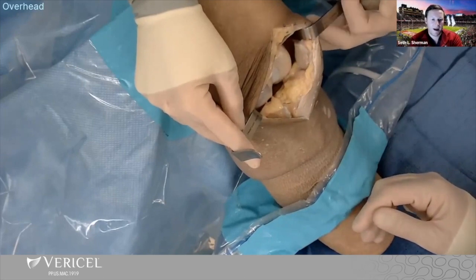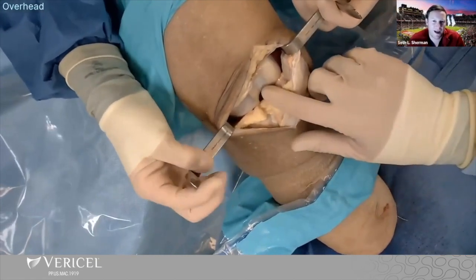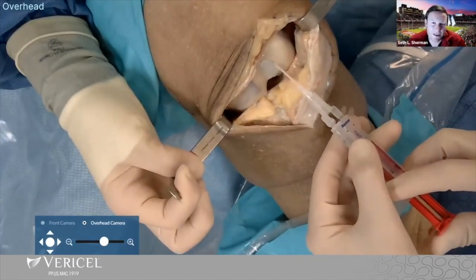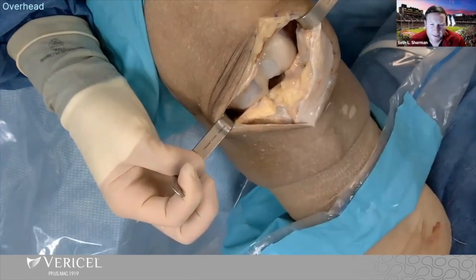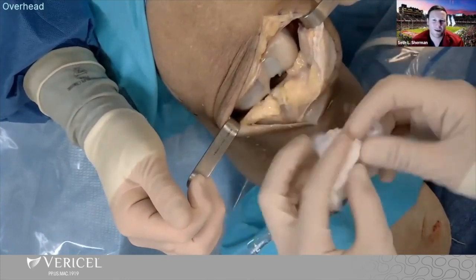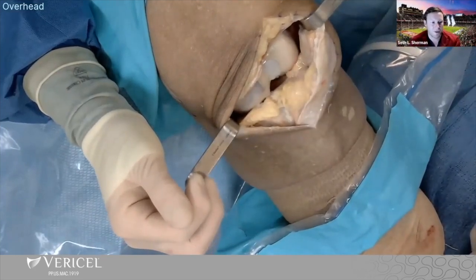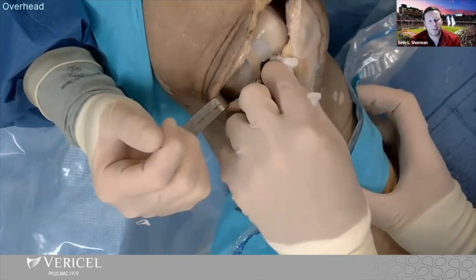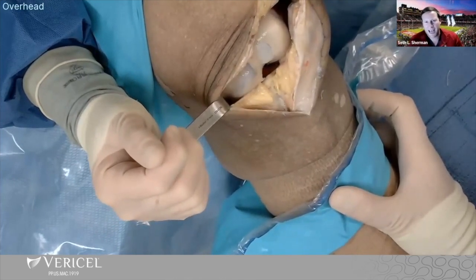If I have larger defects or any areas where I'm less contained or just worried about it, I'll have a low threshold to do 6-0 Vicryl or even mini anchors loaded with that. Those are all options — just less frequent these days with the current-generation MACI technique. The patella cartilage is the thickest in the body, so I actually find I have more comfort in my patella than in my trochlear or condyles — less need to suture in that location. There was a question about concomitant osteotomy, MPFL, and MACI — the order of operations: can you walk us through that?